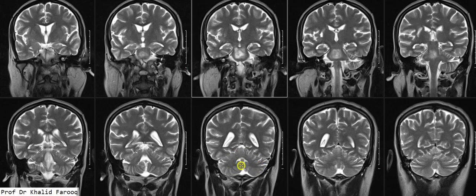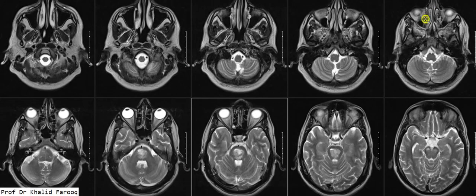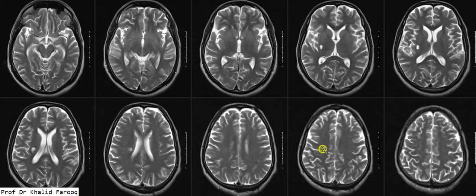Visualized portions of both cerebellar hemispheres are unremarkable with a normal vermis. This can be confirmed on axial images: pontine hemorrhage and ischemic changes in the posterior portion of the right basal ganglia extending cranially into the right periventricular white matter. The corpus callosum, lateral ventricle, third ventricle, and both thalami are unremarkable.